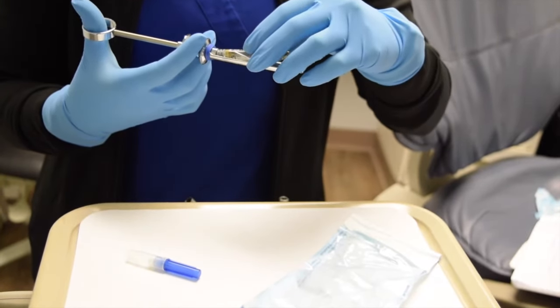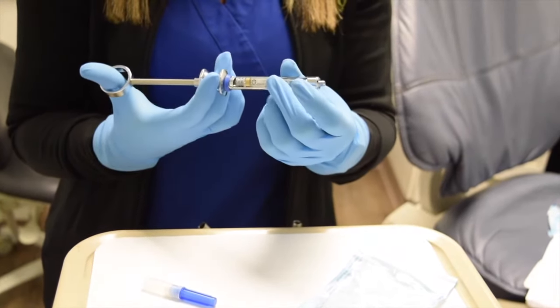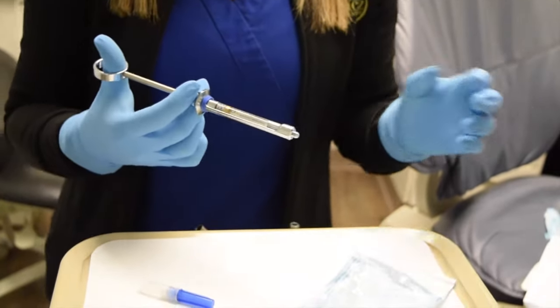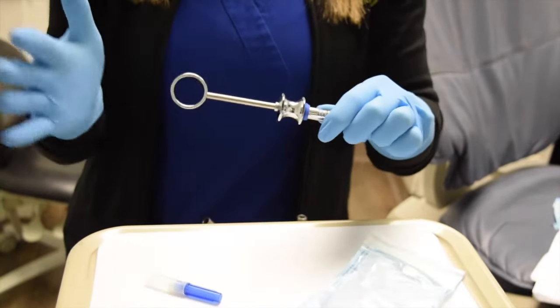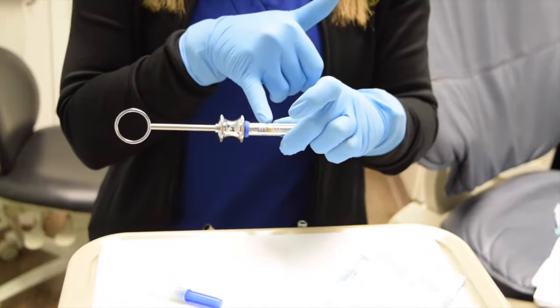The rubber stopper needs to go towards the harpoon and the metal part of the carpule needs to go towards the hub of the syringe. You will then lightly tap on the back of the syringe to engage the harpoon into the rubber stopper.